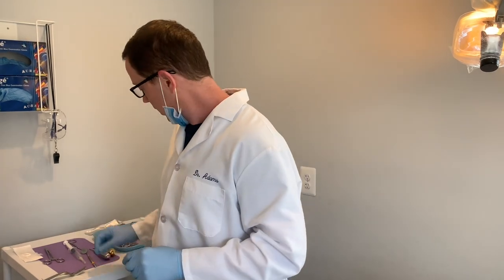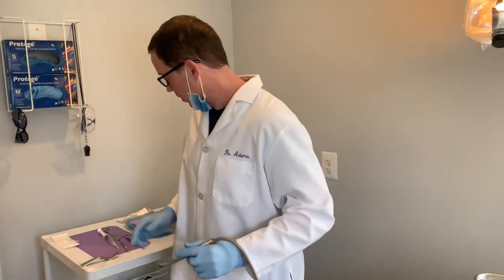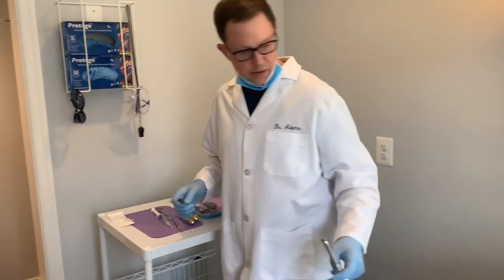And finally, we will take a stitch that dissolves on its own, and we will tie that around the extraction site. The gum tissue used to be attached to the tooth, so it's a little bit loose. And of course, we want to hold the platelet treatment down into the site. The platelet treatment almost looks like a yellow jello, and we'll wrap it around the extraction site a few times to keep the gum tissue nicely approximated up against the jaw, and also hold the platelet-rich fibrin in place. So we're going to go ahead without delay, and we're going to start removing this tooth.